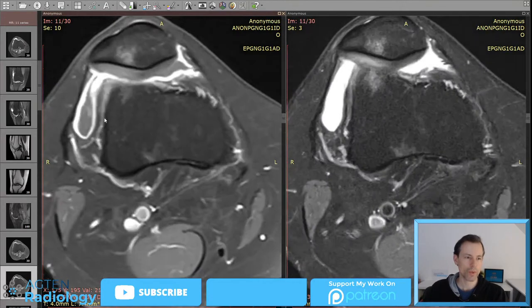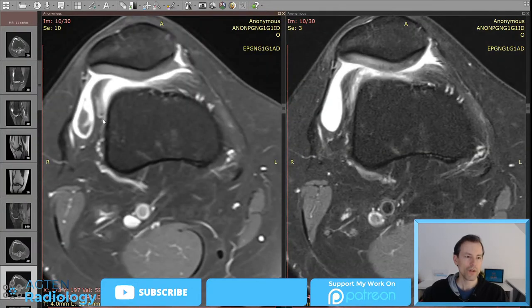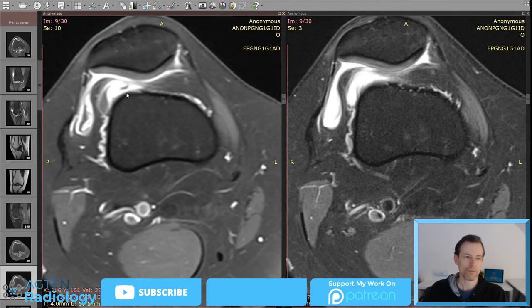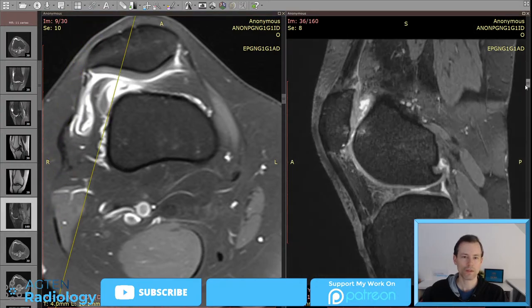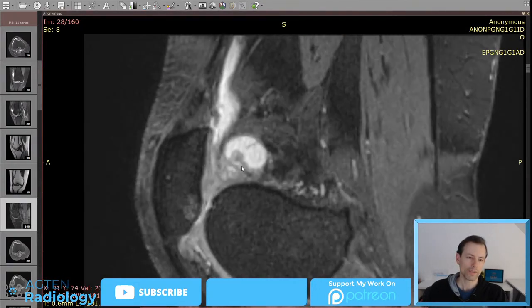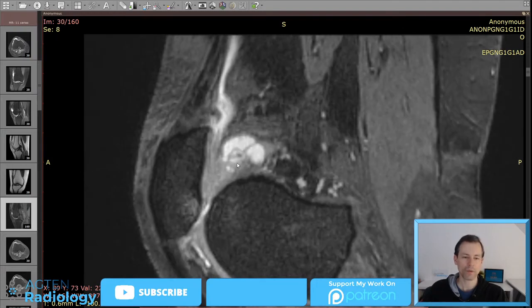So there are two options that we actually have. First of all, it could be either a synovial proliferation or something within here. It could be an indirect arthro effect where you have gadolinium just going in here. But what actually in this case, I think, because it's so polylobulated, remember the very thin slices here with all these tiny cysts here, and if they all show some rim enhancement and maybe even some leaking or sweating of gadolinium outside, then it could be that we have an area with a little bit more enhancement.